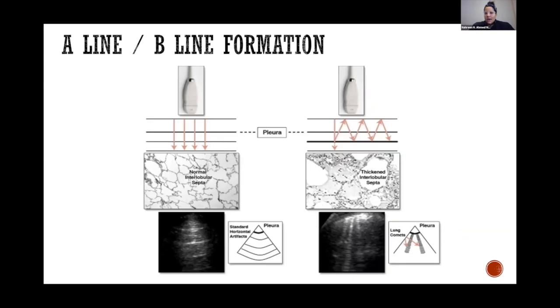So moving on, and to just mention it here, lung ultrasound is really the study of artifacts. Without lung pathology, you cannot actually see anything that gives you an idea of what the diagnosis is. So pathology in the lungs is what creates these artifacts. And the reason for that is because sound waves don't really travel well with air. So the lungs, when they're fully normal, they're aerated, there's really not much to see there that causes scatter of the sound waves.